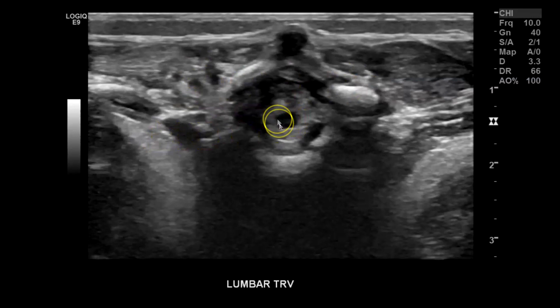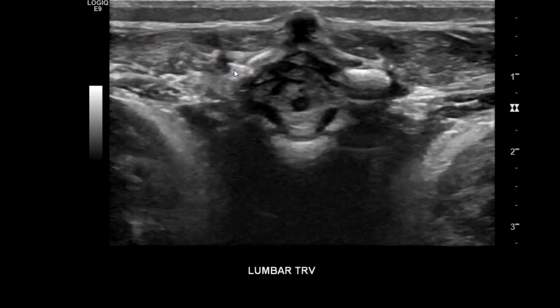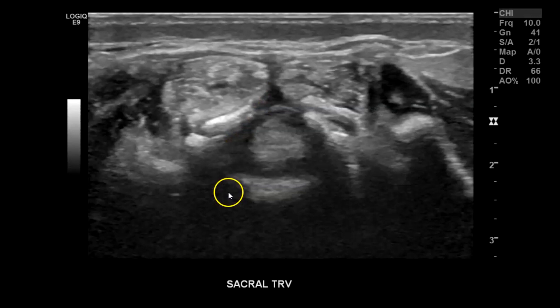Going a little lower, you can already see the tapering down to the conus. I like to do a clip to show movement of the spine — you can see all the nerve roots moving. That's one way to demonstrate spine movement, because in tethered cord the spine is very tight and does not move. Another way to do it is with M-mode: find any nerve root or structure you can see visibly moving within the spinal canal, apply M-mode, and you can see the little undulations and waves of movement.